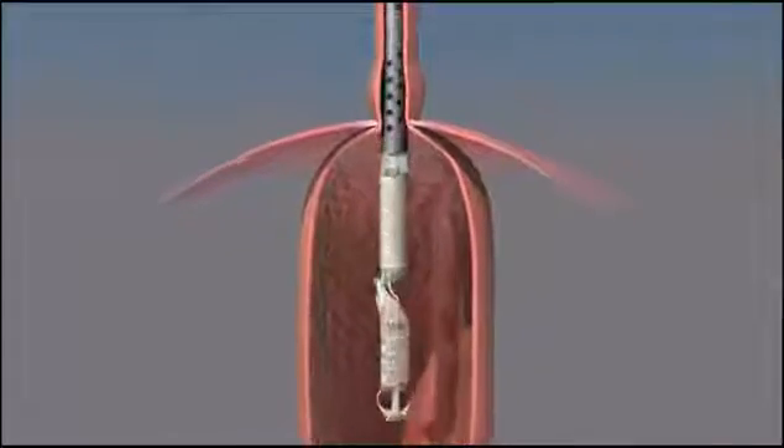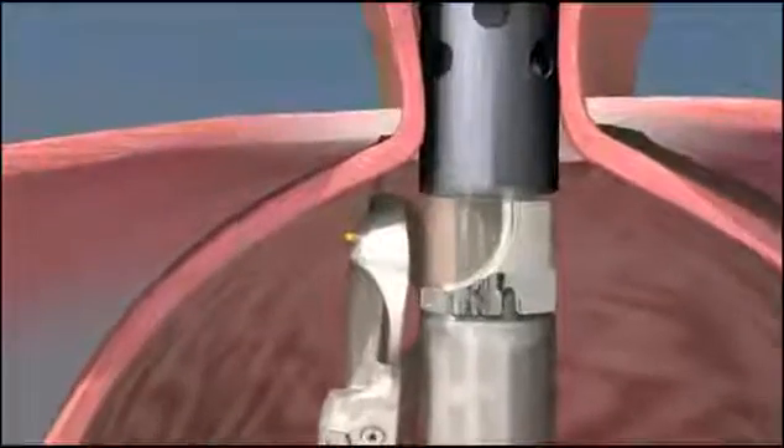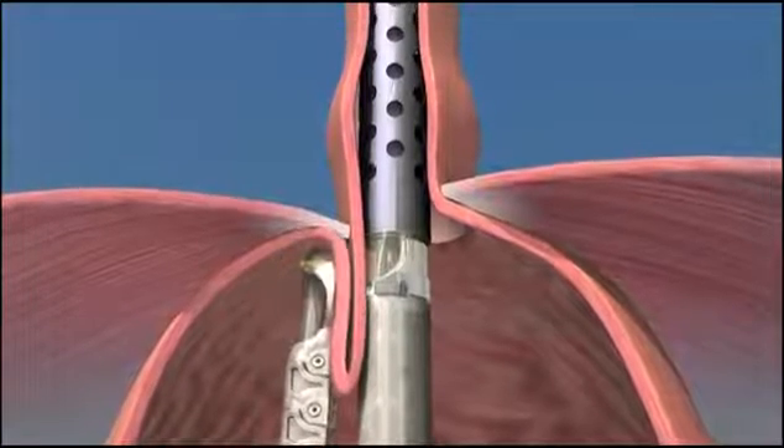The tissue mold is then advanced into the stomach. The tissue retractor is engaged at the Z-line, a line that marks where the esophagus and stomach come together. The tissue is retracted into the tissue mold.